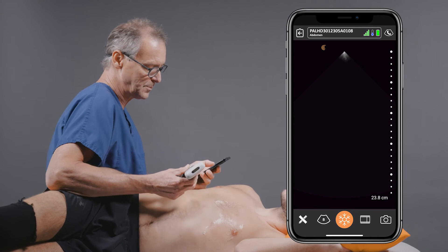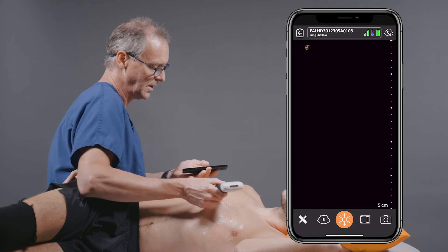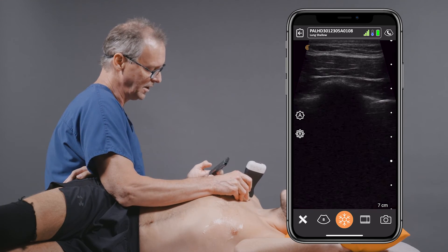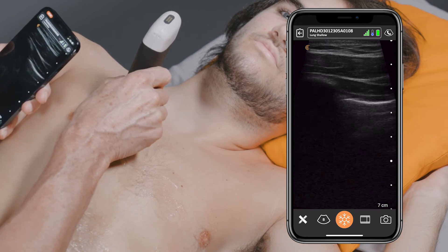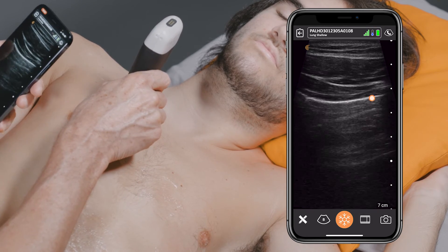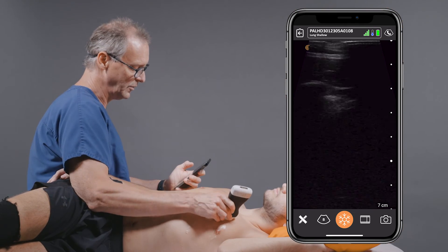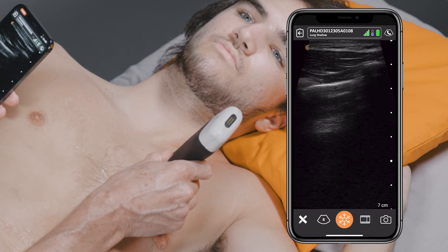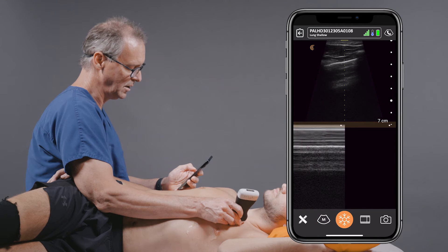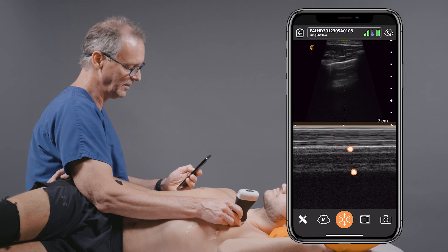Then we'll move to the last part of our exam, which is to examine the pleura and the lung for evidence of pneumothorax or pulmonary edema. Here we can clearly see a rib and a rib interspace — we have nice sliding there and no evidence of B-lines indicating pulmonary edema. Moving to the other side of the chest, again we see pleural sliding and no evidence of B-lines. We can also move into M-mode, where you can look for the sandy beach sign indicating that you do not have pneumothorax.